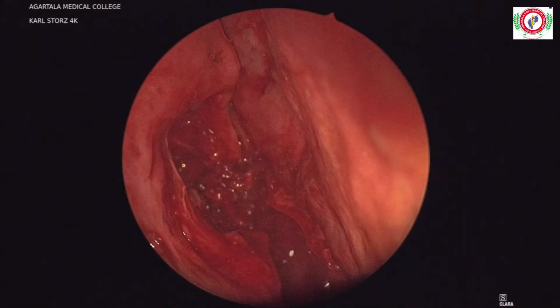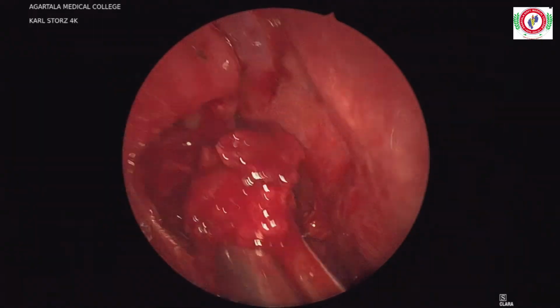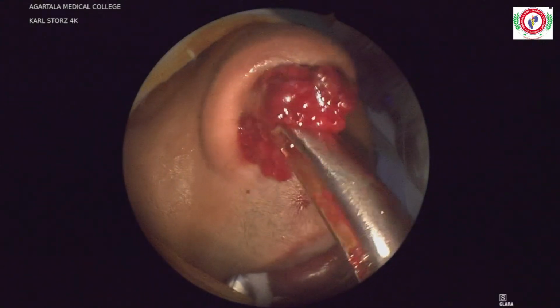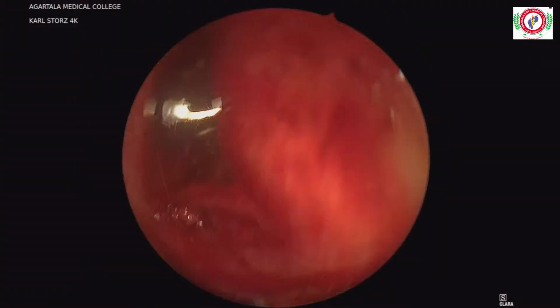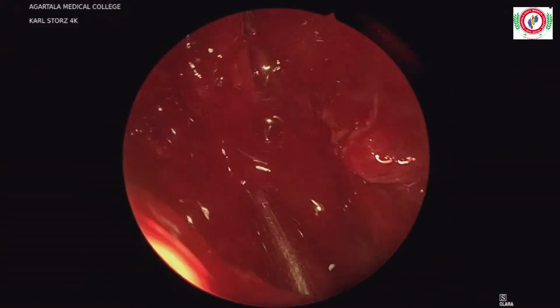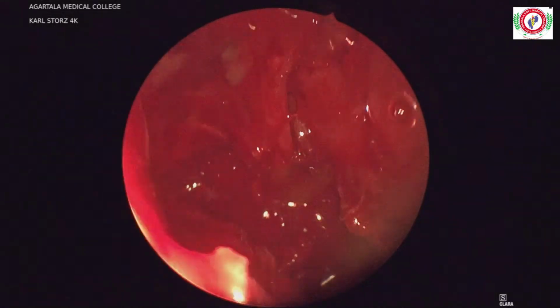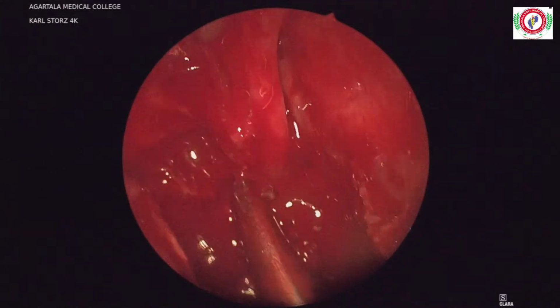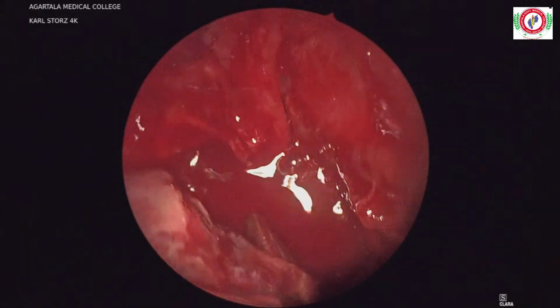Yes. Lux. This is friable, yes. Alright, so this part, look. Yes. Pardon? What you?